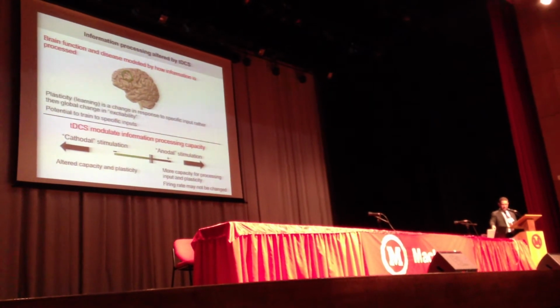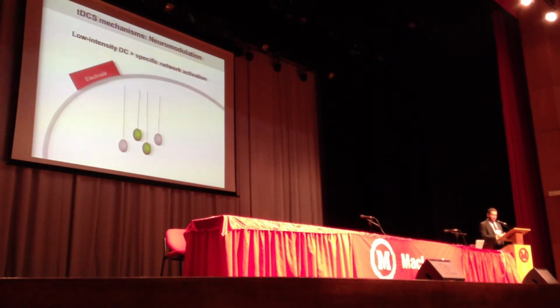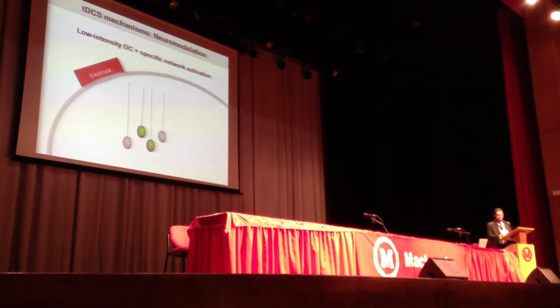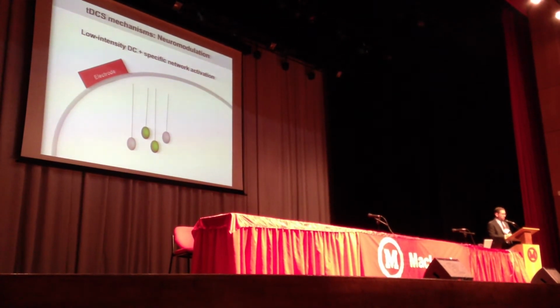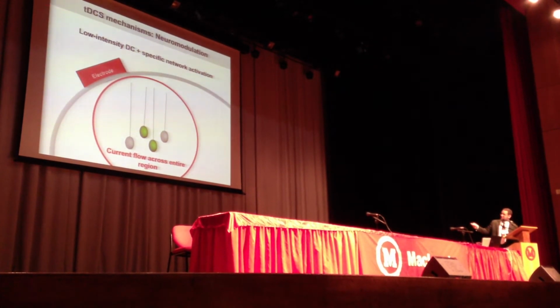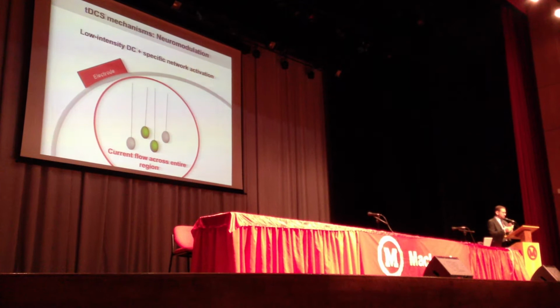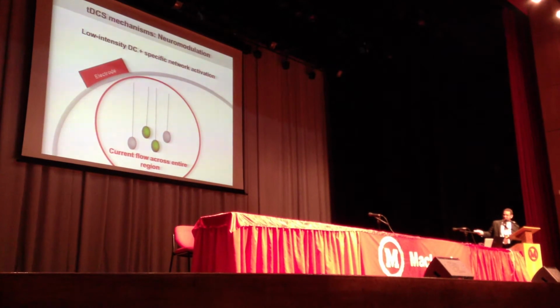Let me just jump to a final slide, because I know I'm running out of time, and explain why I think this processing of input, a theory that we're starting to describe as sort of a gain control theory of tDCS, is very important. You can focalize tDCS, certainly with high definition tDCS, but only up to a point. And actually, the vast majority of tDCS is not done with particularly focalized stimulation at all. And so if I have a group of neurons here that's near the electrode, they're all going to be stimulated. I cannot stimulate one and not the other. They're overlapping in space, right? They could literally be microns apart. No montage we could ever design could stimulate these cells of interest and not these cells.